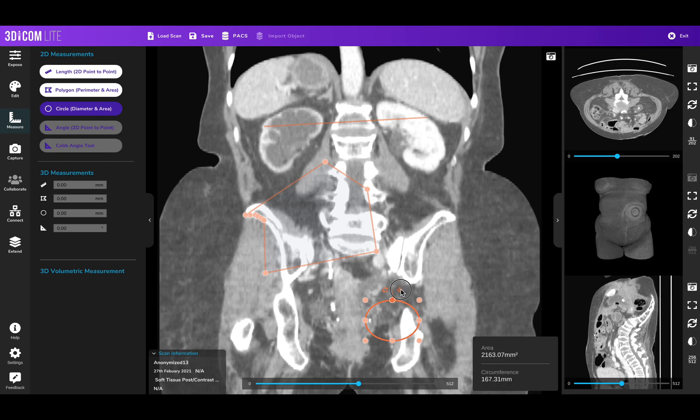The differences between 3DICOM Lite and 3DICOM Pro and Surgical are numerous, and include the fact that 3DICOM Lite does not allow you to store your measurements and also does not allow for 3D measurements.